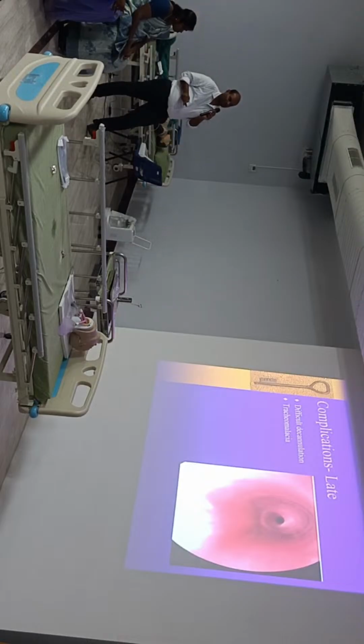This is a picture where, as I said, tracheal suctioning is done as a blind procedure with plastic tubes, causing repeated injury. The trachea above is normal. The tracheostomy tube sits here, you can see the mark, but the obstruction is at the level below. This is a result of stenosis, that is narrowing of the airway occurring below the level of the tracheostomy tube, as a result of poor suctioning technique. There can be a fistula formed between the trachea and the esophagus or the skin.